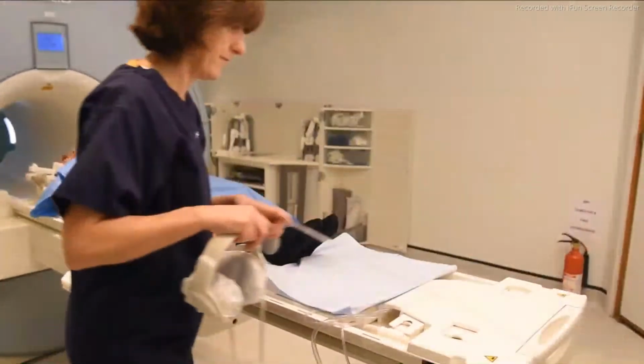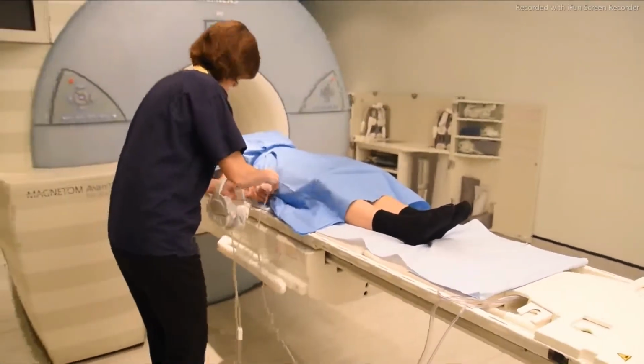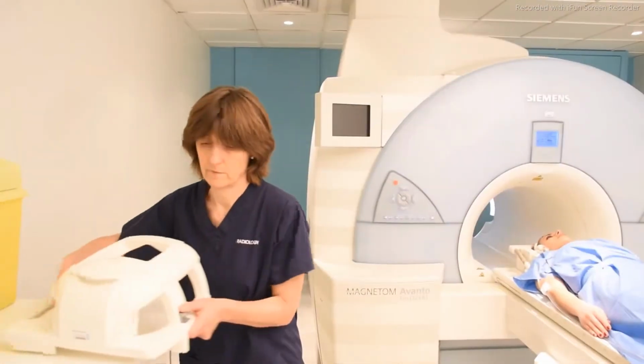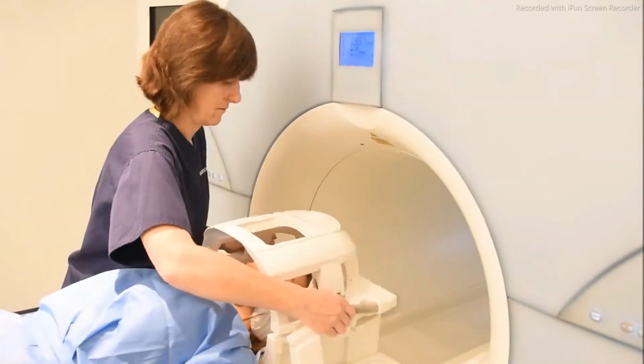Provide the patient with an emergency buzzer and make sure they know how to use it. Provide headphones to protect the patient's ears. And put the head coil in place.